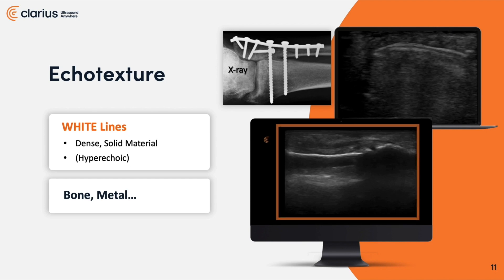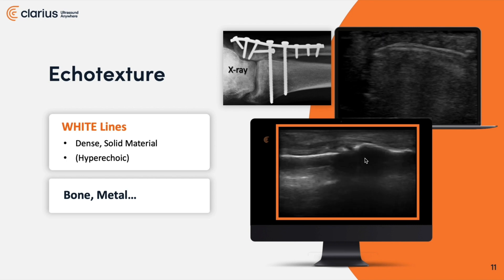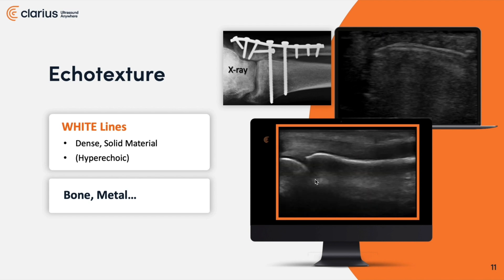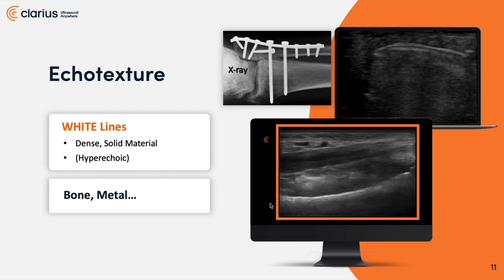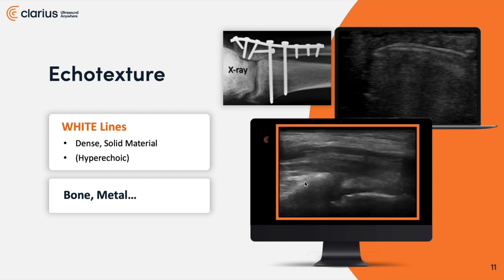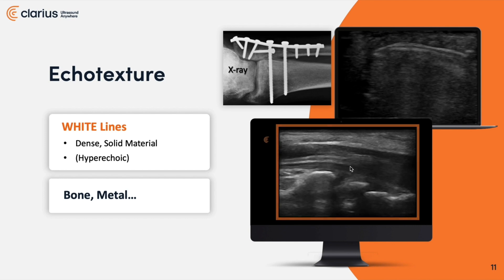This is a distal finger — the distal phalanx. Take a look at the bony echoes here. You can't help but be in awe that you're actually able to see the flexor tendons of the flexor digitorum profundus. Looking at the white lines, consider this dense echo texture. Follow along: this is the distal phalanx, this is the DIP, this is the middle phalanx, this is the proximal phalanx. You can see the metacarpal head go to the base, and we're now seeing carpal bones all the way down to the distal radius. I want you to take a look at these bony echo signatures.